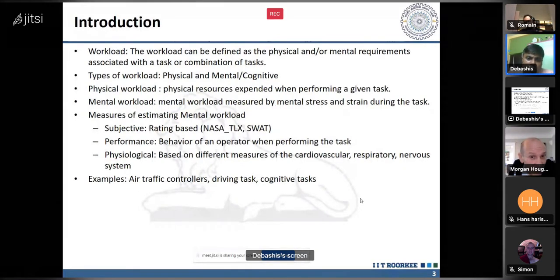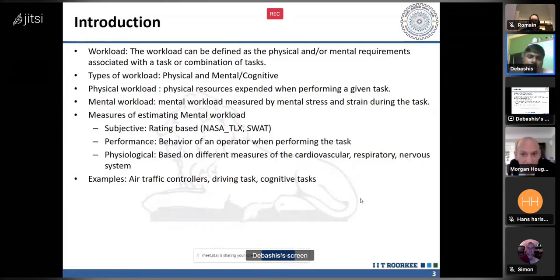Actually, I don't use performance measures so much. I think the physiological measure is not mapped with these performance measures, because it's a behavioral task, so it's more dependent on the subjective ratings. If you take the ratings from the subjective measures, like the NASA TLX, then apart from the classification with the deep model and machine learning classifier, you can use a statistical test. For two-class classification, you can use the Wilcoxon rank test, so you can see whether it is significant or not.